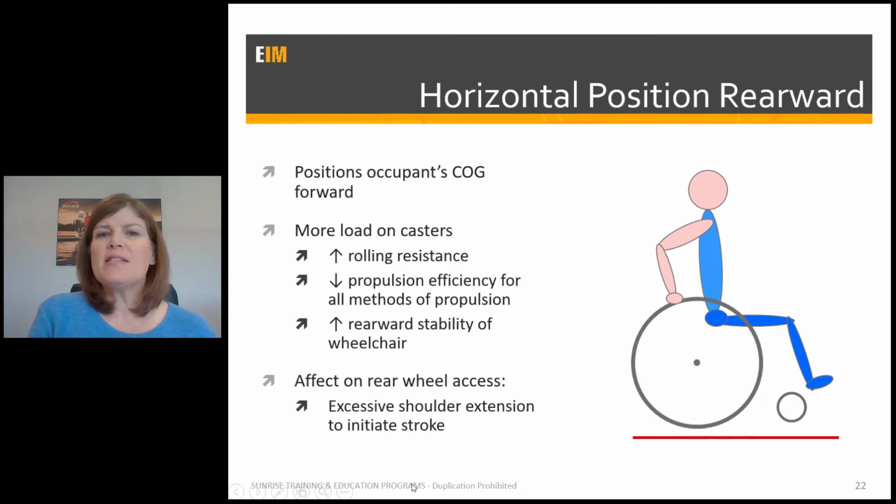So as I said, this is typically speaking how your standard wheelchairs are set up, that the axle of that standard wheel is close to the rear of the frame. There are some models that do have, say for example, a 1-inch offset in the rear wheel for that center of gravity, so it's a little bit more forward, but it may or may not be sufficient for your particular client.